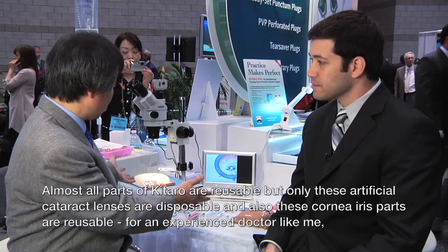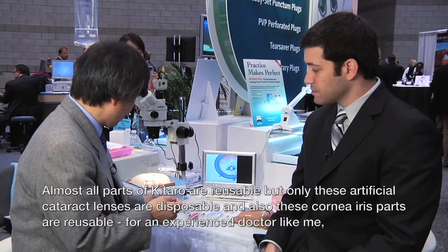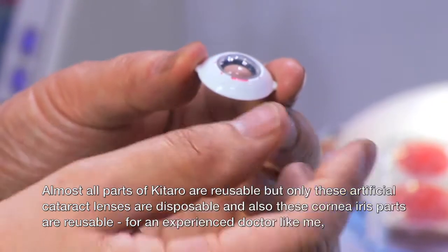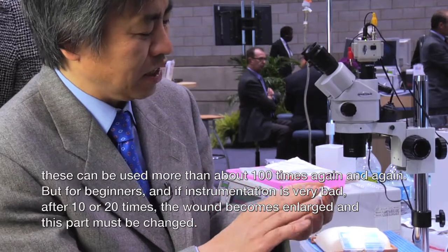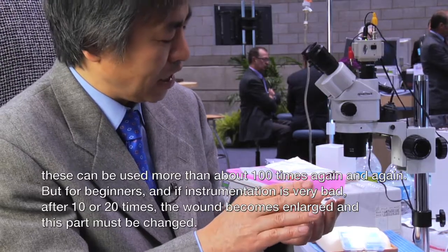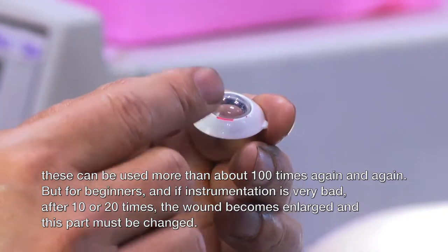Are these parts reusable? Almost all parts of Kitaro are reusable, but only the artificial lens is disposable. The cornea iris part is reusable — for experienced doctors, it can be used more than 100 times. But for beginners, if instrumentation technique is poor, after 10 or 20 uses the wound becomes enlarged and that part must be changed.